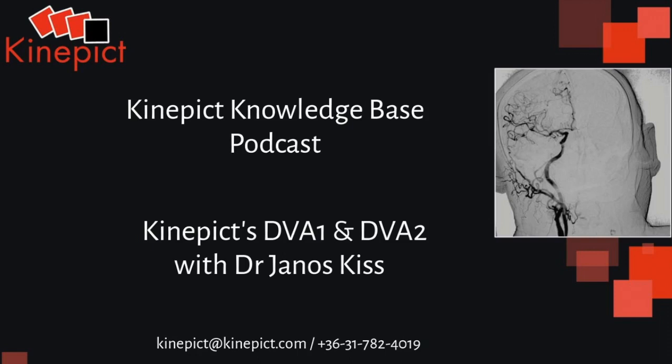We finally found that although under normal conditions DVA1 and DVA2 perform very similarly, in these extreme situations like the dose management studies, DVA2 performs better than DVA1.